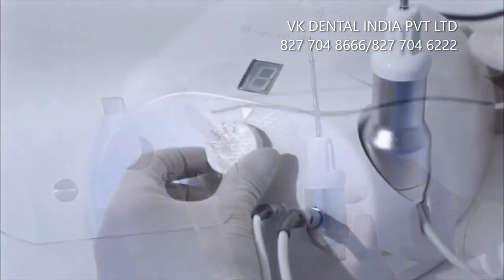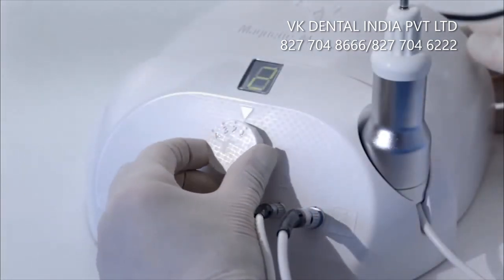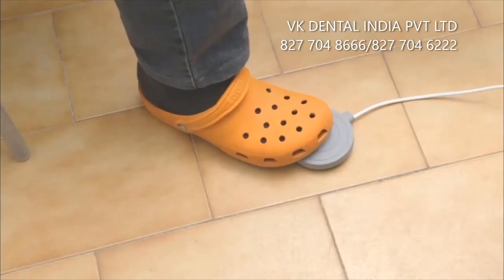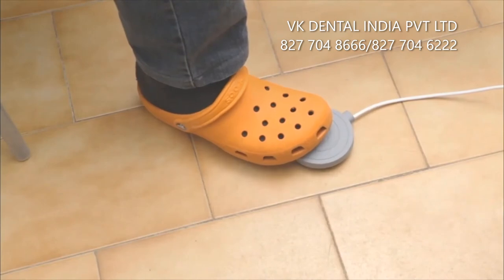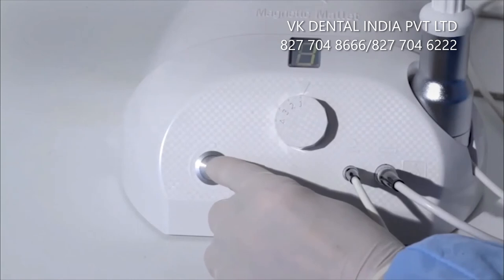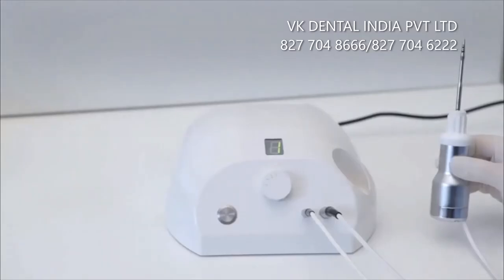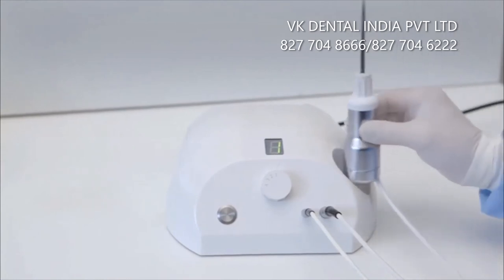The device is designed to apply 4 forces of different strengths and the handpiece is operated through its ergonomic foot switch. If needed, it can also be operated by the manual button placed on the power supply. The handpiece can be easily placed in its housing during the various steps of the surgery.